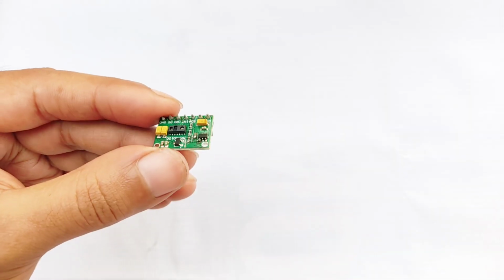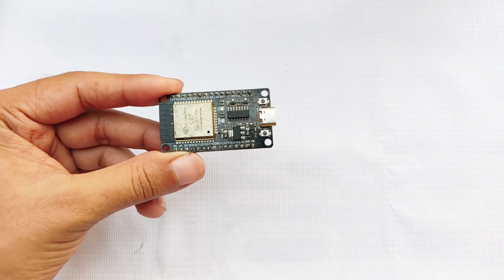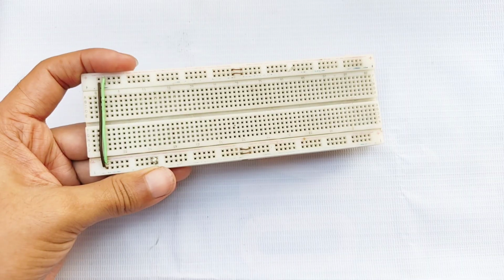Here, we'll need a MAX30100 pulse oximeter sensor, an ESP32 board, an OLED display, some jumper wires, and a breadboard. First, we'll set up the hardware.